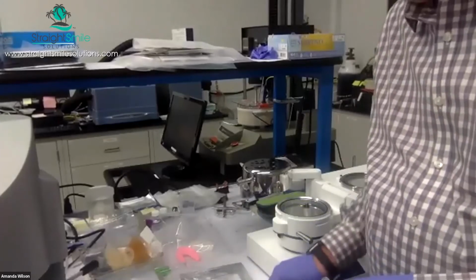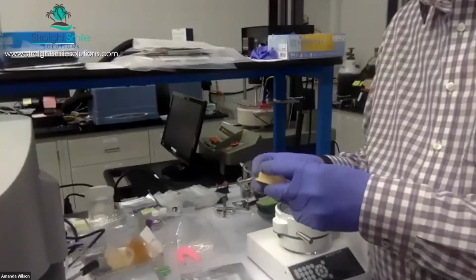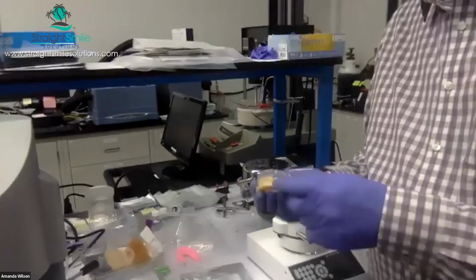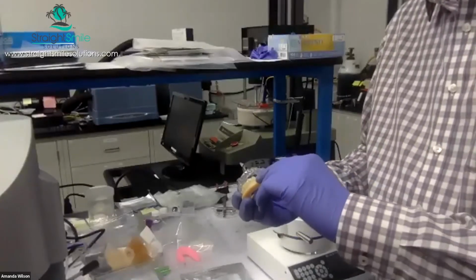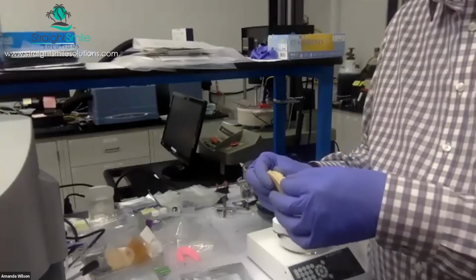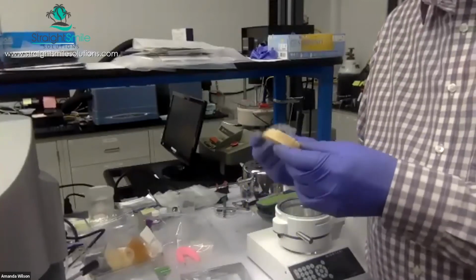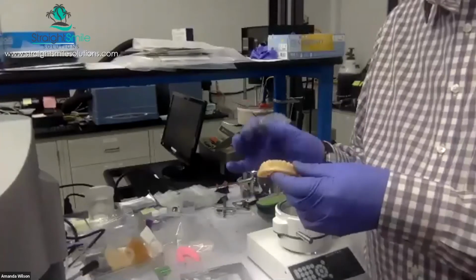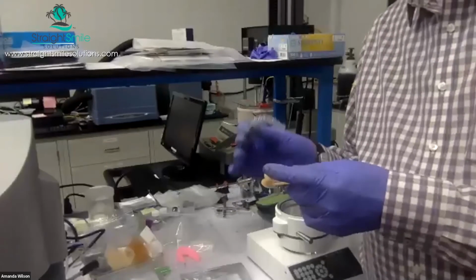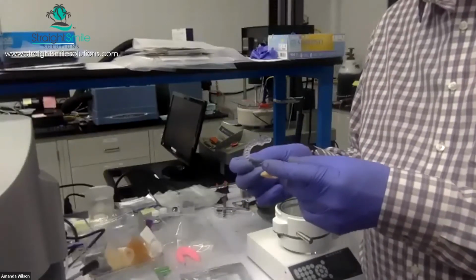If you measure the retention of the device on the model, or the force that it takes to remove the device, for sure, if you trim with a relatively straight line, leaving just a small amount of material at the gum level, but without scalloping, that increases the retention force of the device on the patient. And we believe that increases the forces that the device is placing on the teeth as well.